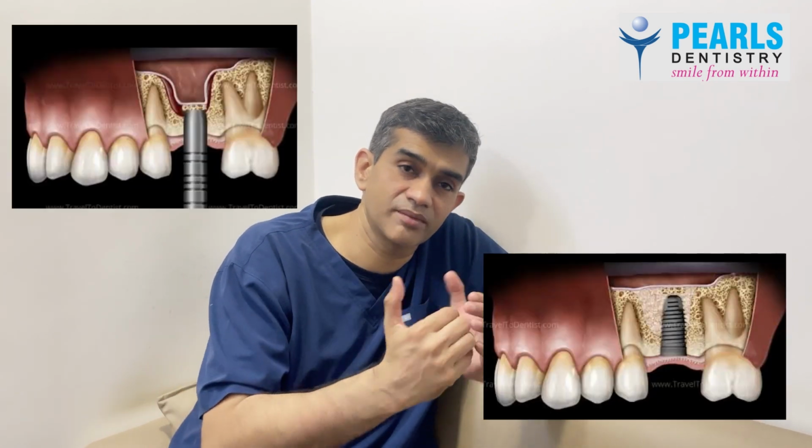Of course, we need to follow certain precautions and certain principles when we do the sinus lift surgery. In this procedure, the sinus is lined with a membrane, right? This membrane is what limits the sinus to the surrounding bone. During sinus lift surgery, in the posterior region of our upper jaw, this membrane is lifted up. So what happens when the membrane is lifted up?